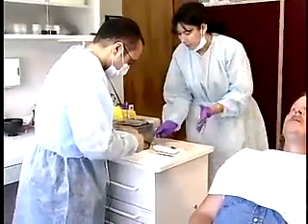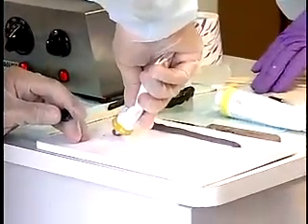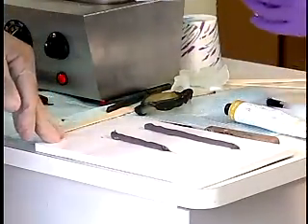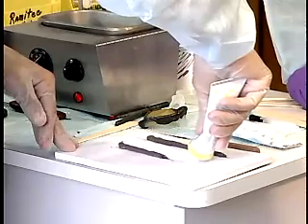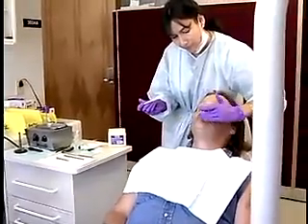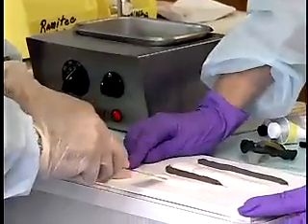If using rubber base impression material, place equal 4-inch lengths of light body base and catalyst on the mixing pad. Place Vaseline over and around the patient's mouth and lips. Mix until homogeneous.